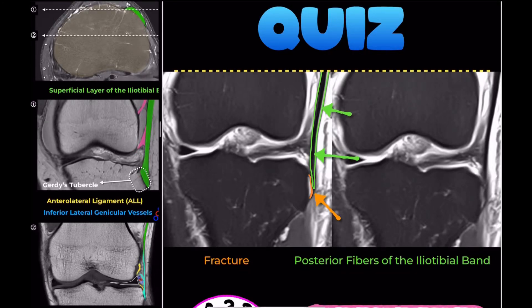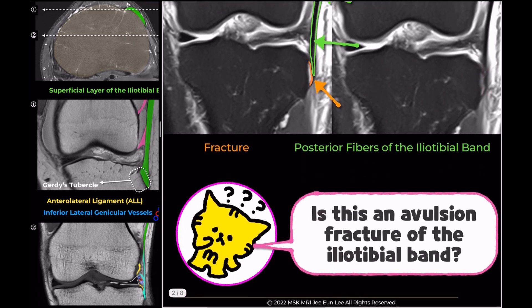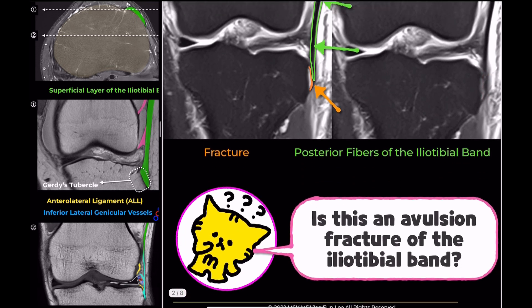The area highlighted in green represents the iliotibial band. There is an avulsion fracture at its attachment site. So the question arises: should we call this an iliotibial band avulsion fracture?